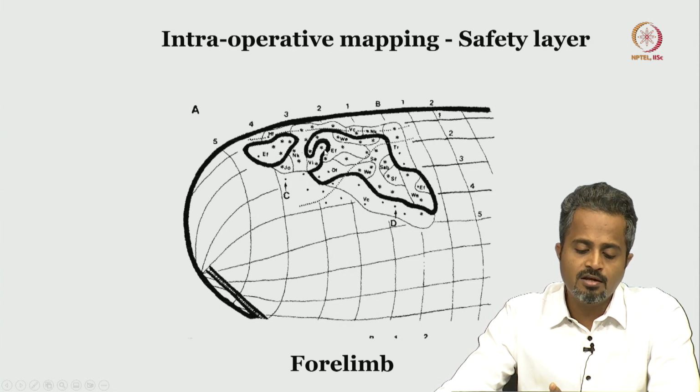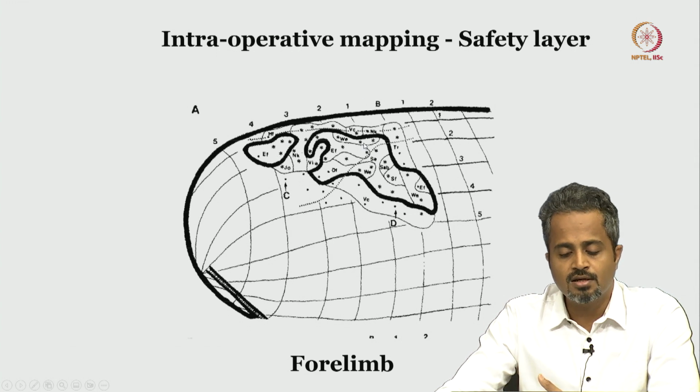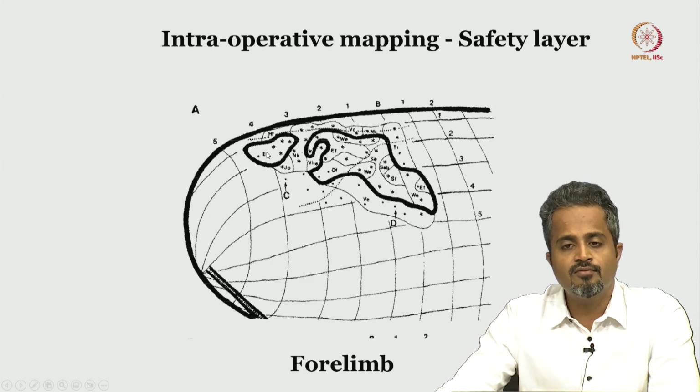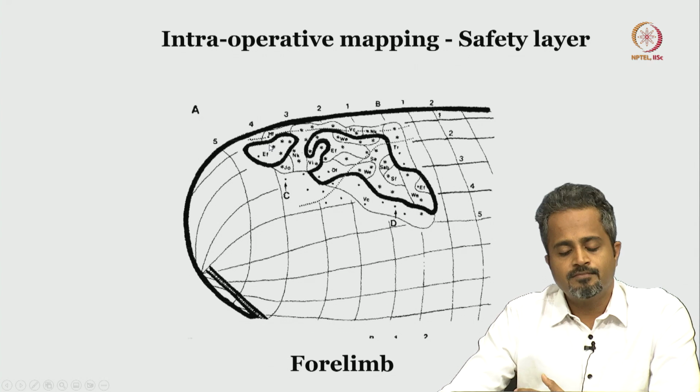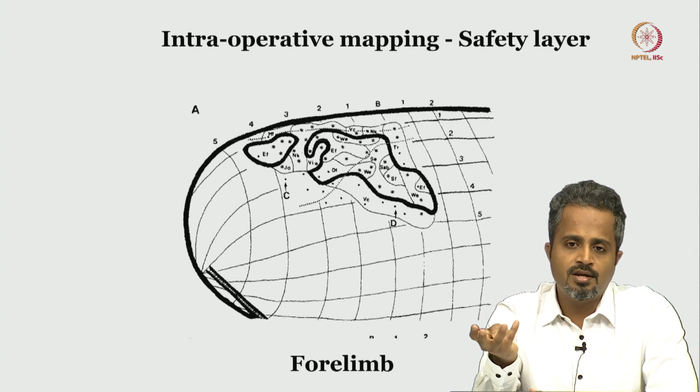For example, if the proximal joints are moving and not the distal, you definitely know that you are dealing with the rostral forelimb area. Similarly, the caudal forelimb area. So, as I said earlier, you are depending entirely on the coordinates.